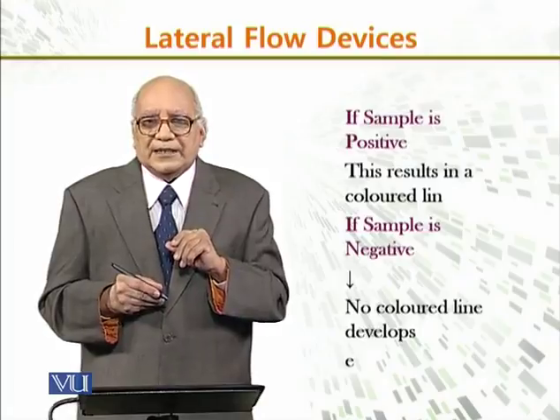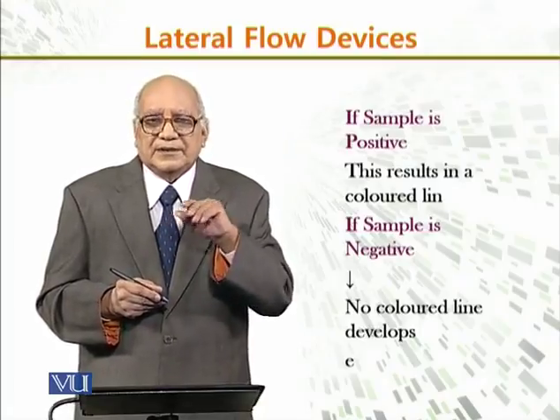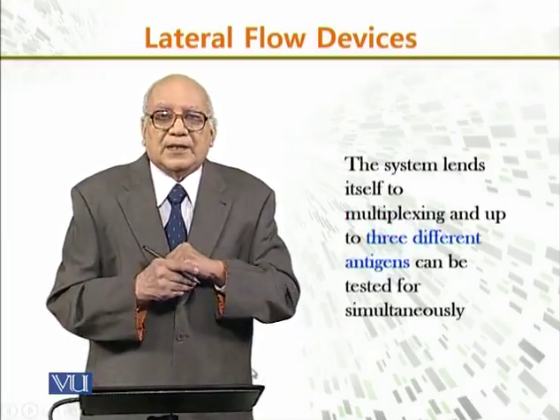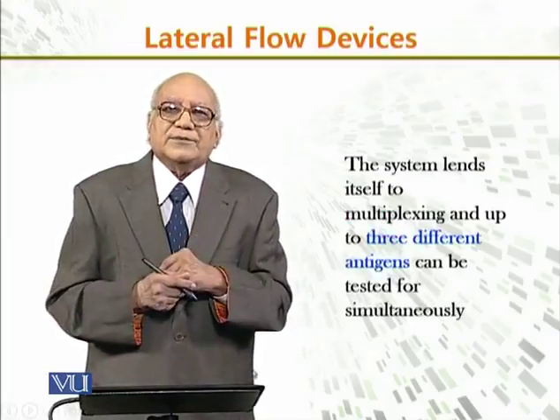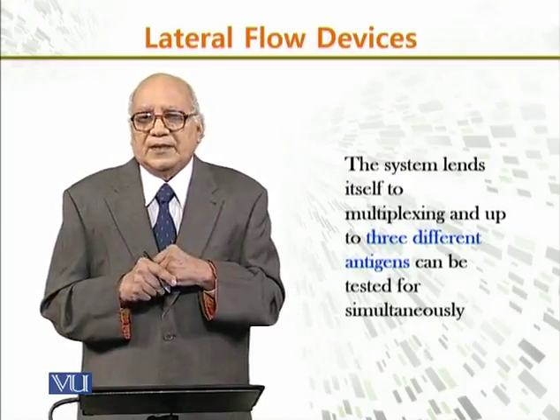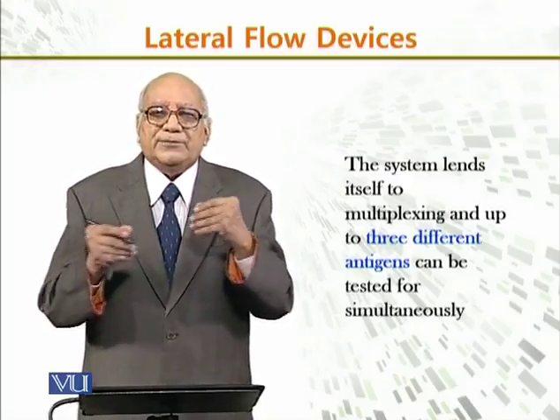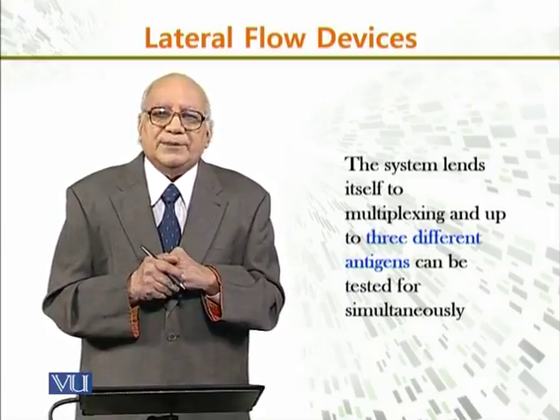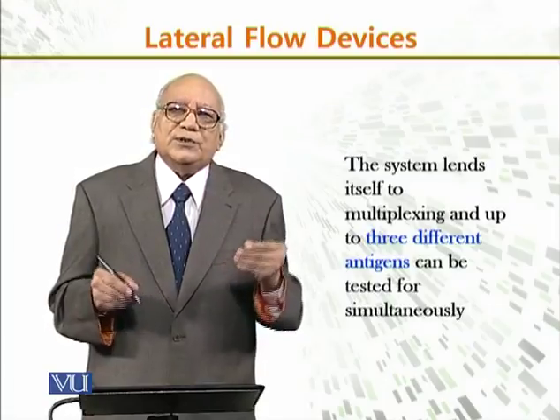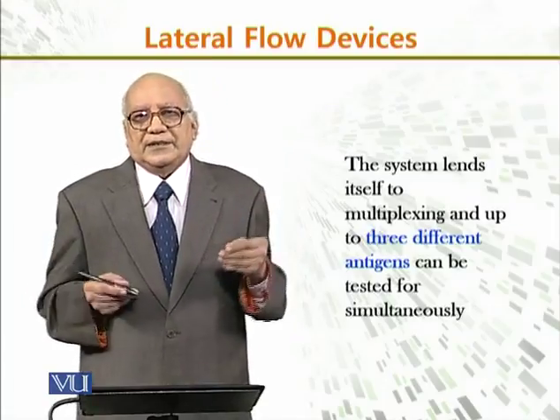If it is negative, no colored line will develop. Now the system lends itself to multiplexing, and up to 3 different antigens can be tested for simultaneously. So it is not only for one antigen.